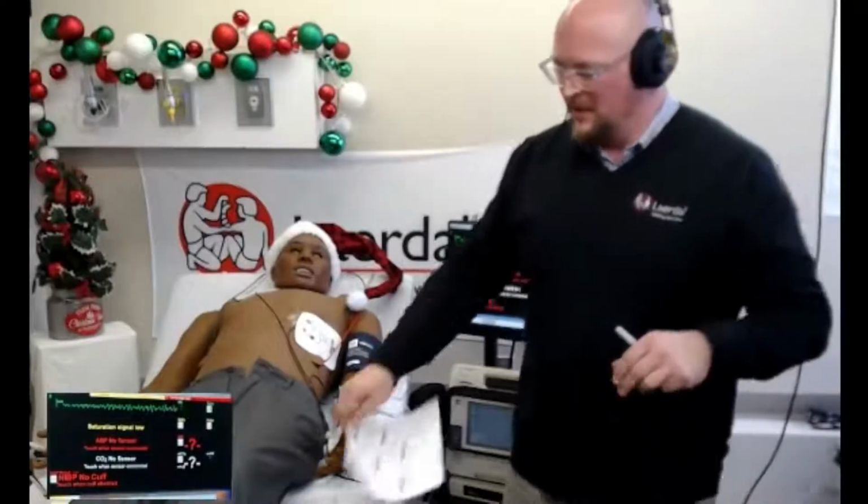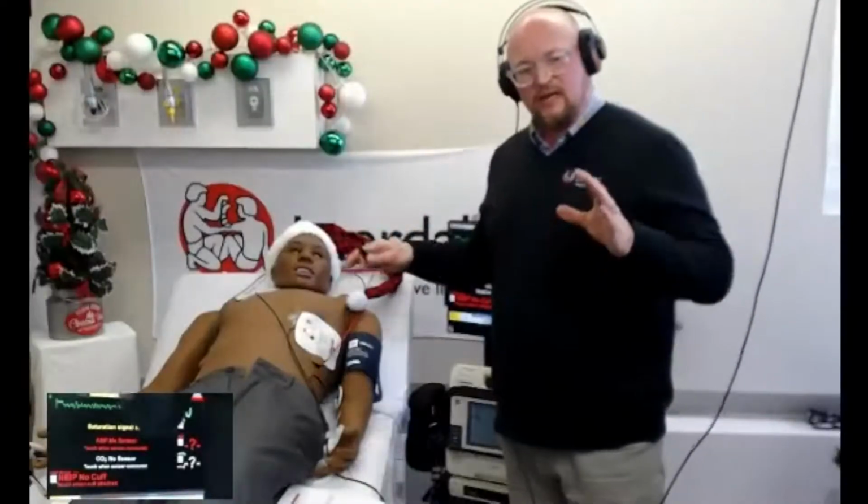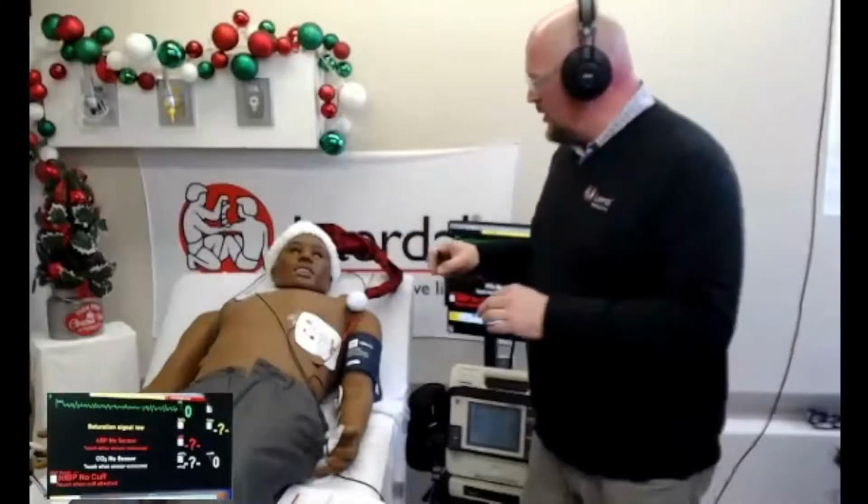There we go. Oh, thank you. That's the SimMan 3G Plus, my little bit of a product demo. Does anybody want to see anything else? Is there anything else you want me to show you?